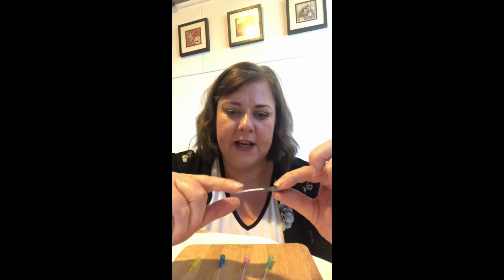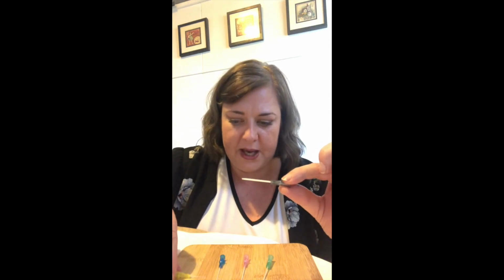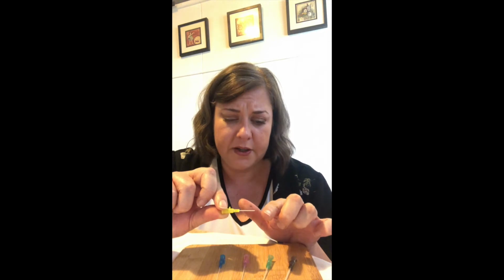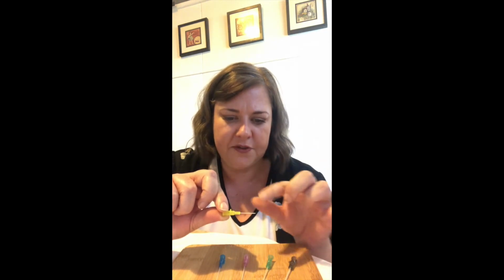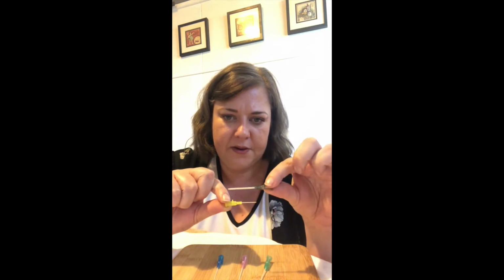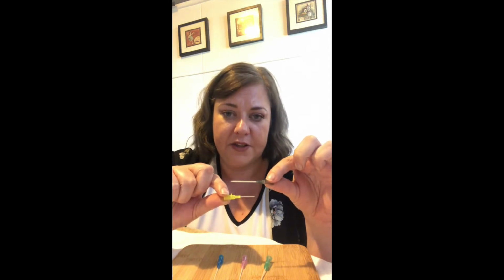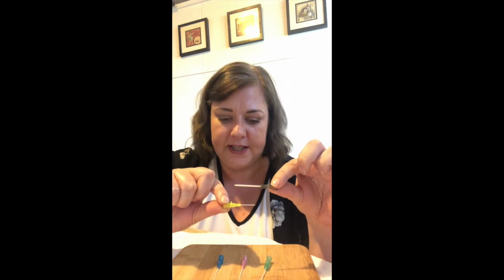So here we have the grey 16 gauge cannula, and you can see that it's quite long, it's quite thick, and it's pretty rigid. Now, just to compare, we'll jump all the way down to our smallest cannula, which is our 24 gauge yellow cannula, and you can see that it's quite a lot shorter, it's much finer, and it's very pliable. So the differences between the two you can see, and the more practice you have at using cannulas, the better you'll get at using them and remembering these concepts.